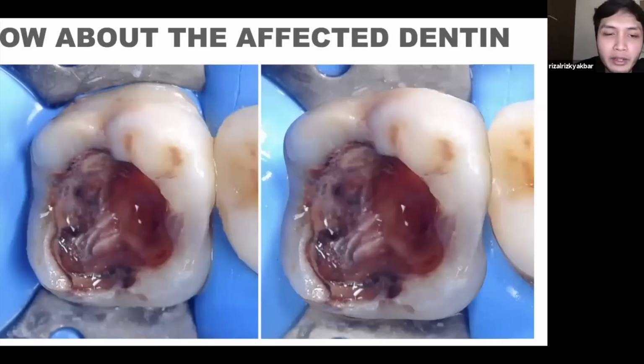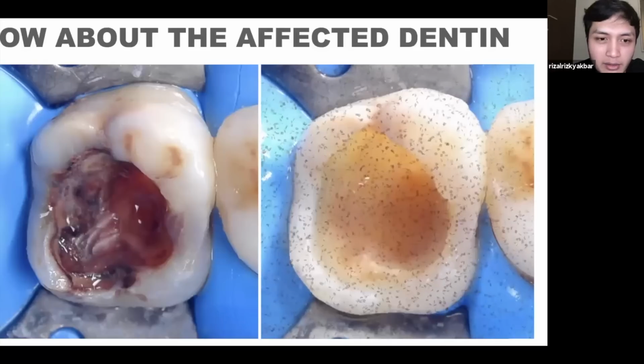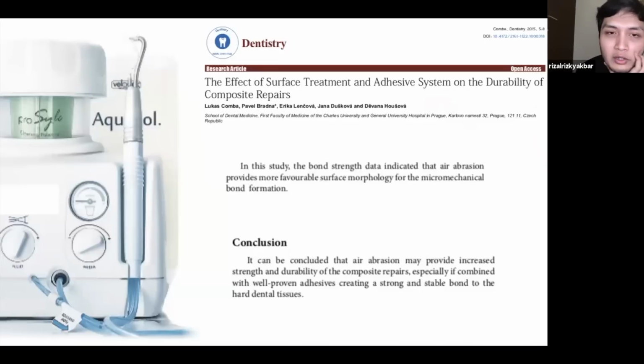And how about the affected dentin in posterior? Yeah, sometimes you leave the affected dentin. Actually, it's safe to leave the affected dentin as long as you remove all the infected dentin. Yeah, but if you want, you can use this one.